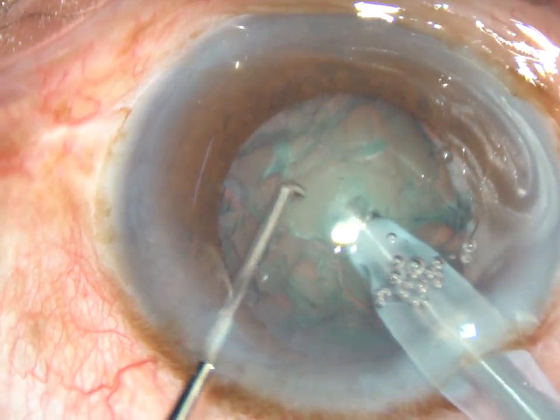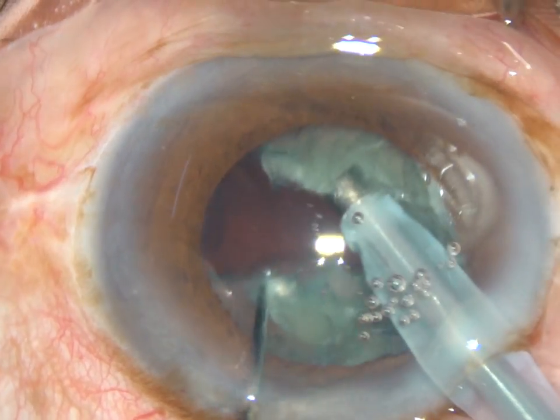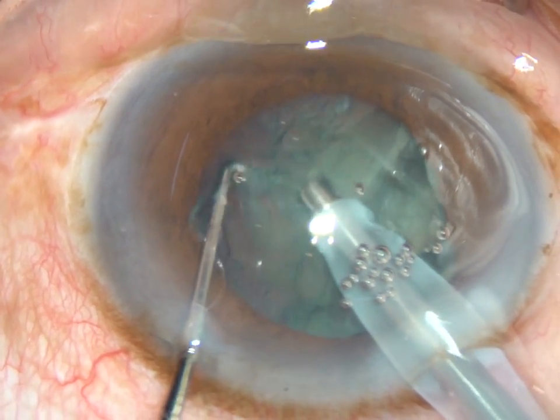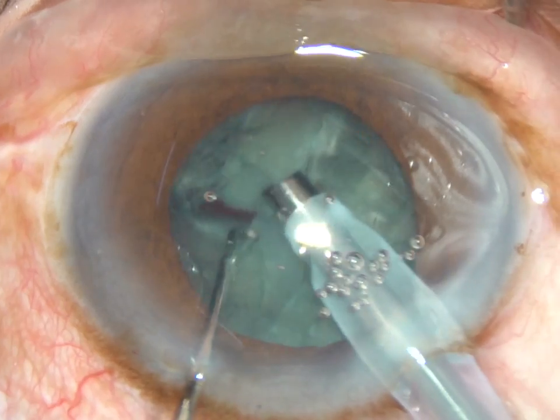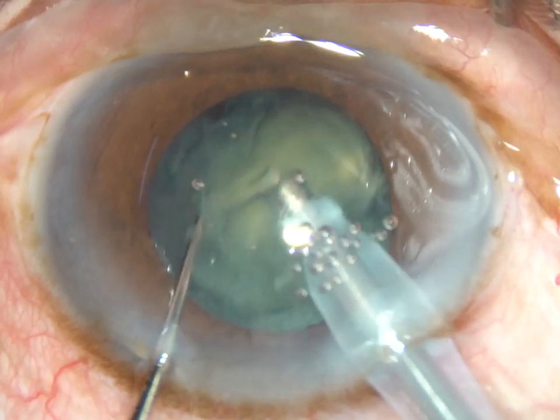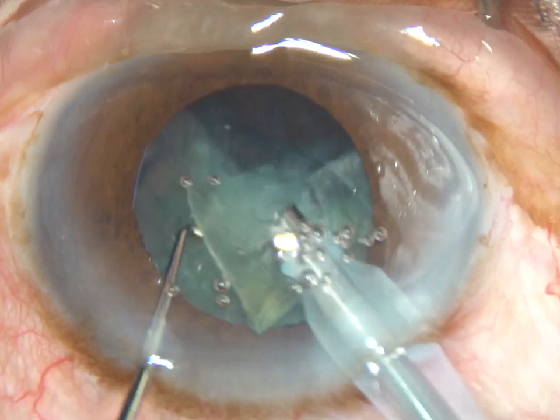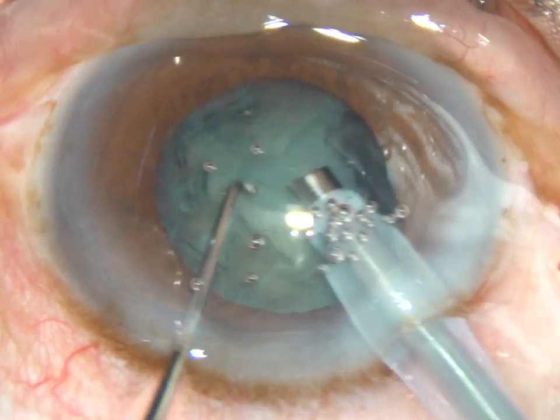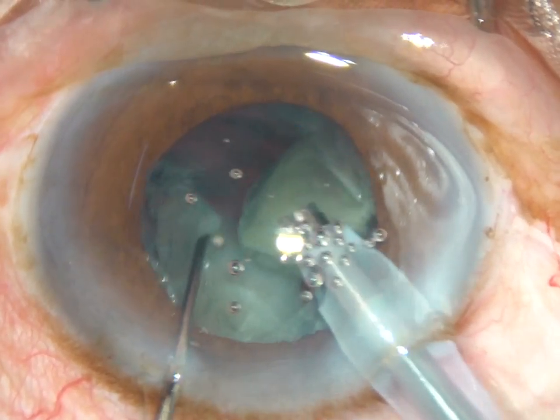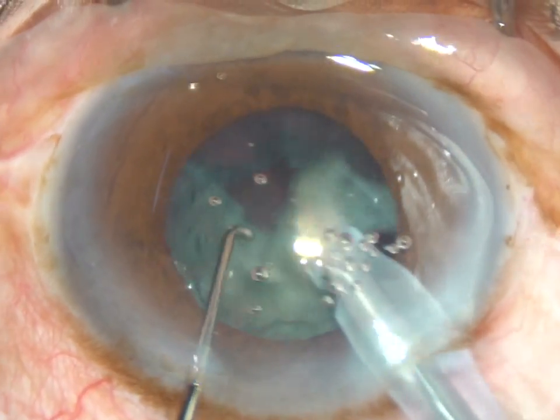I go into the substance of the nucleus and chop it like this. Again go through the substance and chop at another place. Now this free nuclear fragment is emulsified and removed. The nucleus is rotated and along the initial crack this piece is separated from the other hemi nucleus.